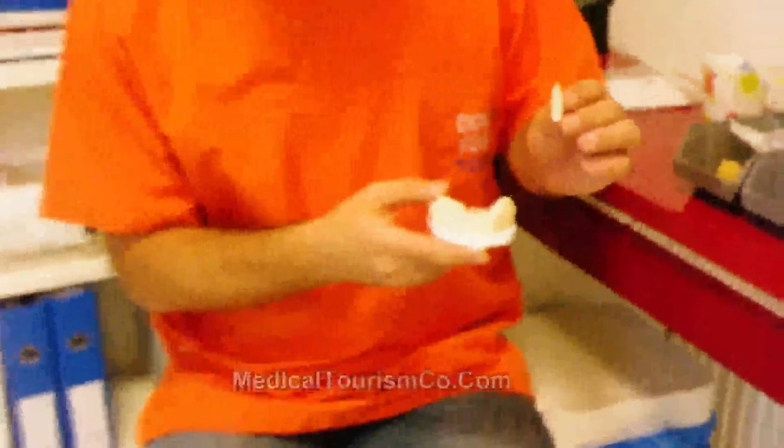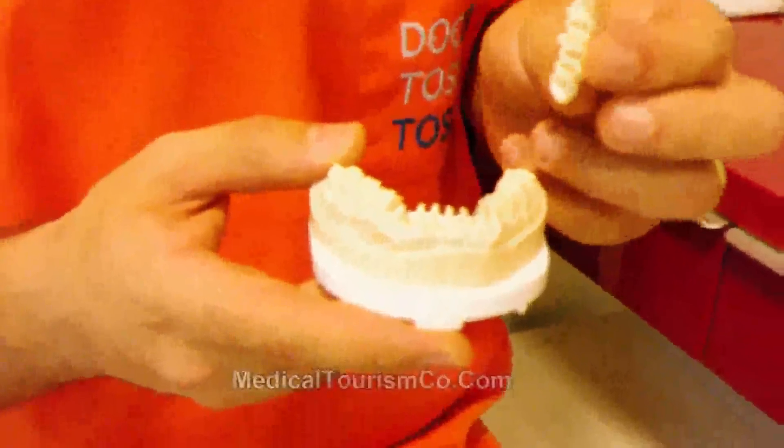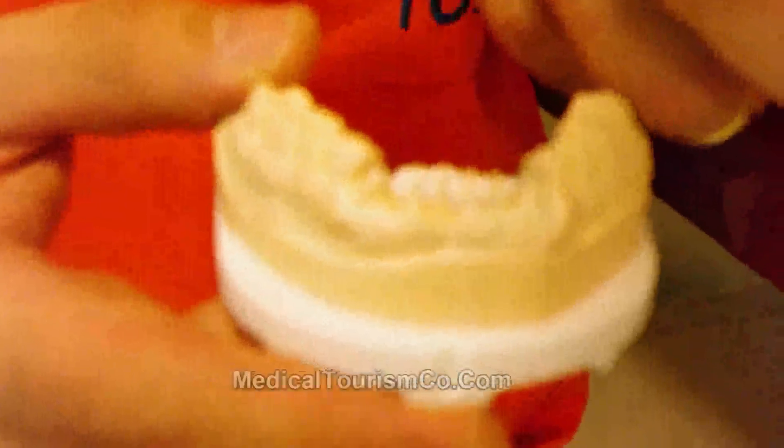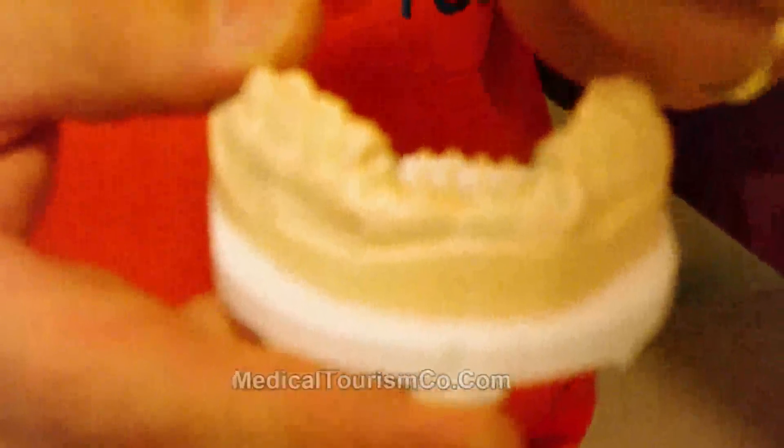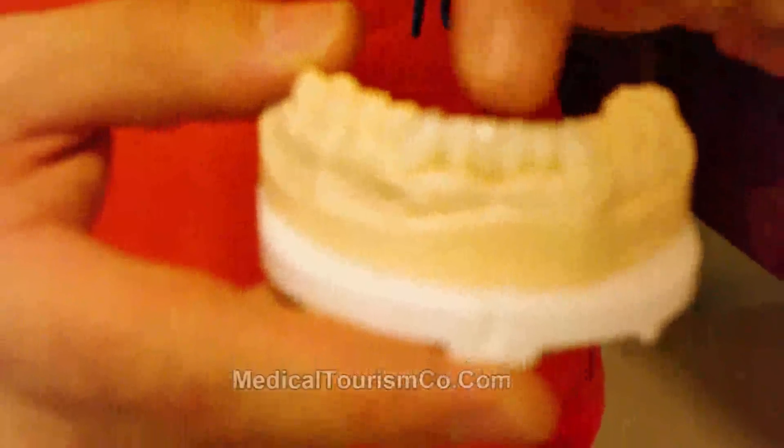As you see, here we have teeth with bone loss, so we prefer to splint them together with a zirconia bridge. The veneering material is porcelain again in this case.